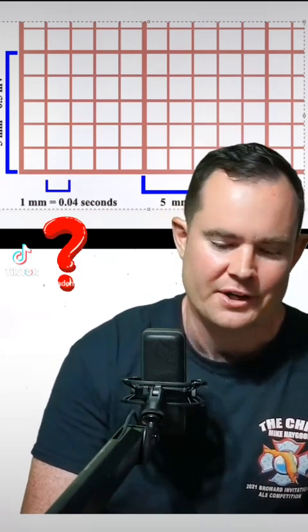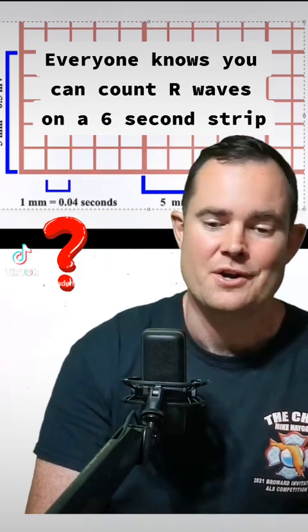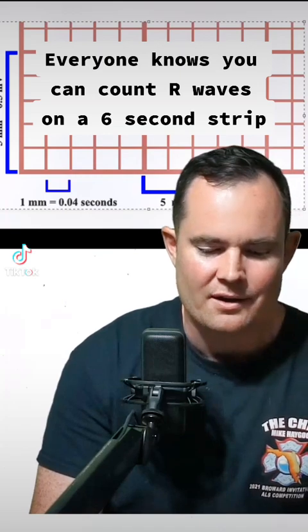So I'm sure most of you are going to say, Mike, what does it matter? My monitor tells me what the heart rate is. Well, what if you don't have the heart rate on your monitor? Or what if it's a 12 lead EKG? Everyone knows a 6-second strip, you can count the R waves, but let's go ahead and talk about another type.